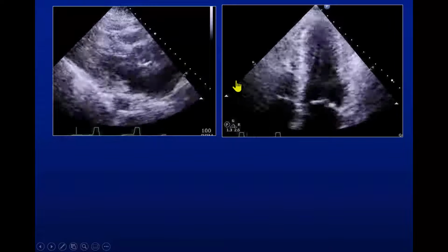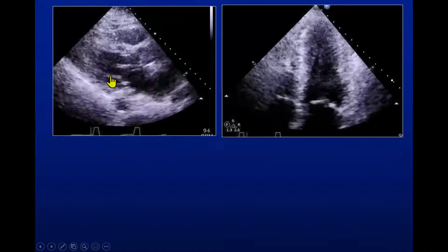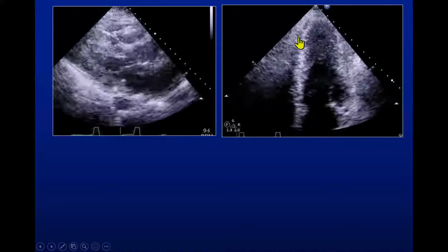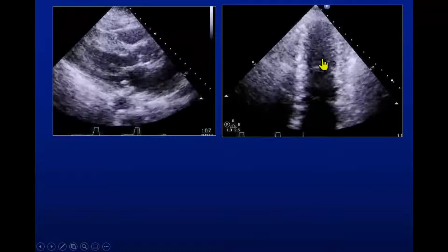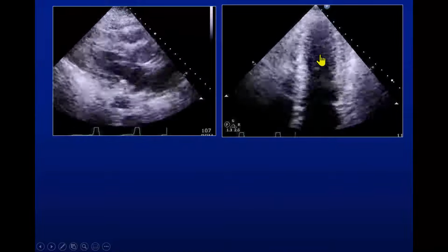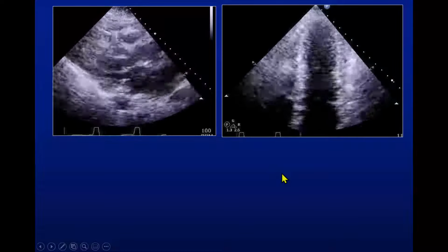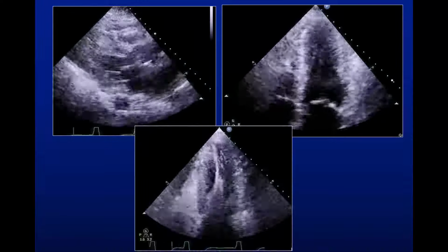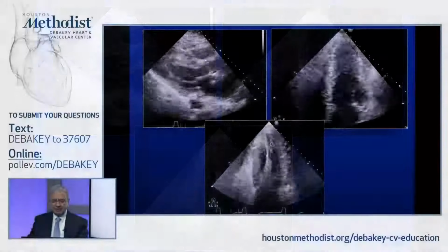This individual has an interesting wall motion. You could see hypertrophy here, the base of the posterior wall, not that hypertrophied, but an interesting wall motion here, meaning the outside of the heart is not contracting as well, is not moving inward. Do I have more muscle? Is this an apical hypertrophy, or is this an akinetic apex? But I don't see a cavity here. I'm suspicious of an apical hypertrophic cardiomyopathy, but not completely diagnostically full-fledged. And you could see them very nicely here, that you have an apical hypertrophic cardiomyopathy.